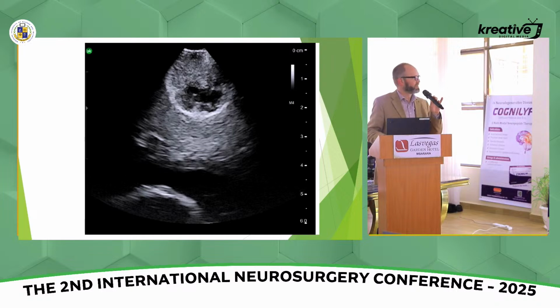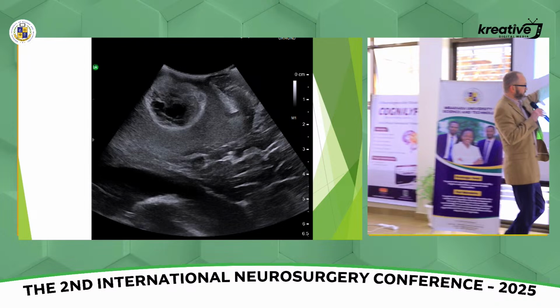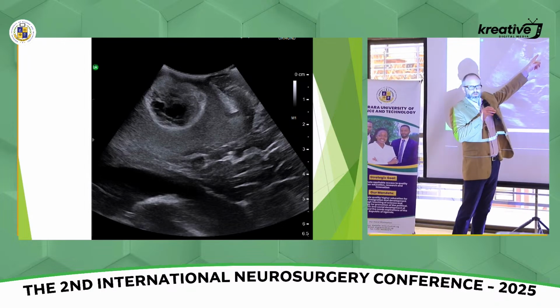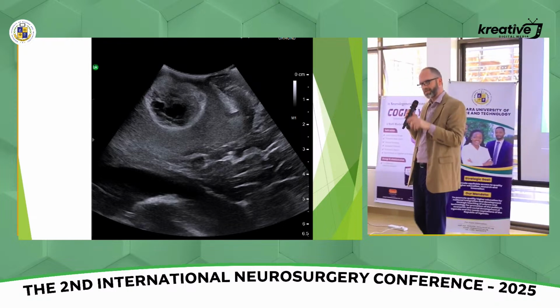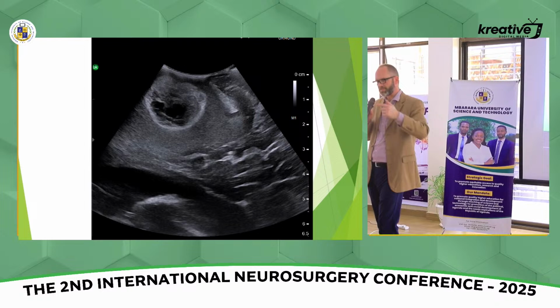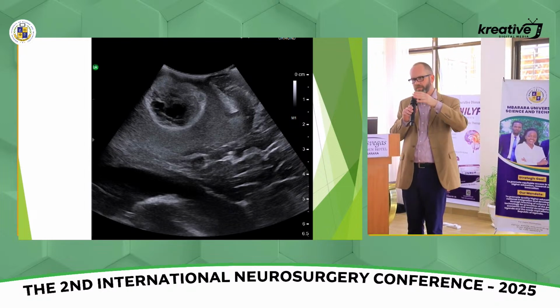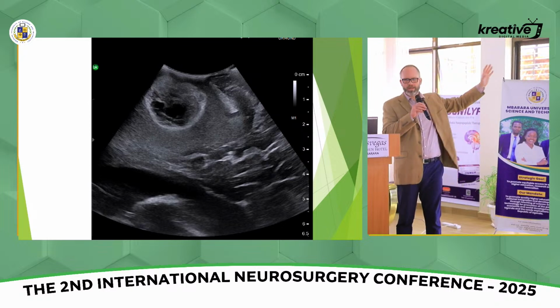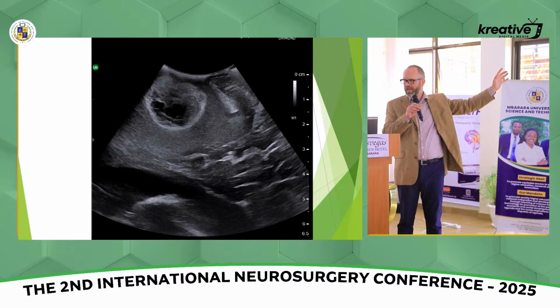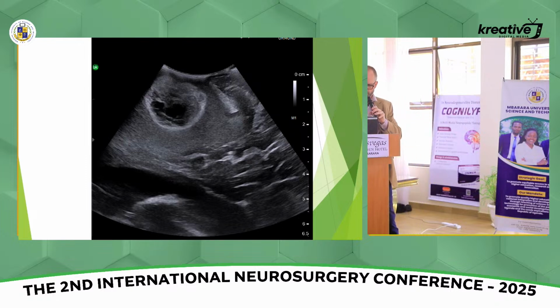This is another picture of that same patient, now after resection. We have a little bit of cytotoxic edema around the margin of resection. How you know that's not tumor is that you've either taken pictures of the screen to refer back to, so you freeze and save those images and look back to remind yourself, and you've looked frequently, multiple times with the ultrasound over the course of the procedure. You'll watch that part of the brain change over time, so you know it's cytotoxic edema and not residual tumor.